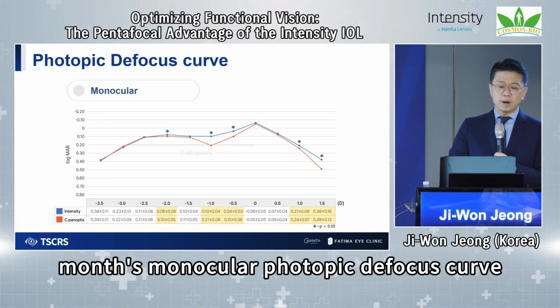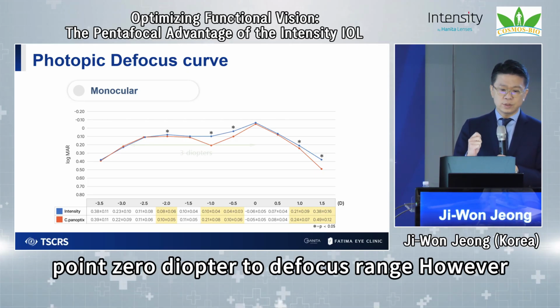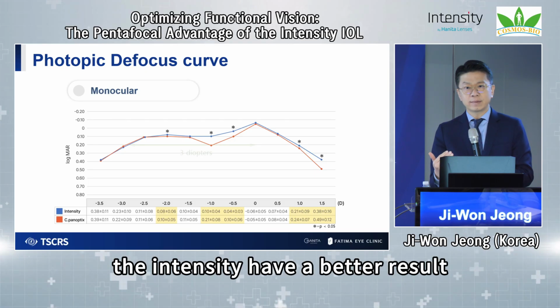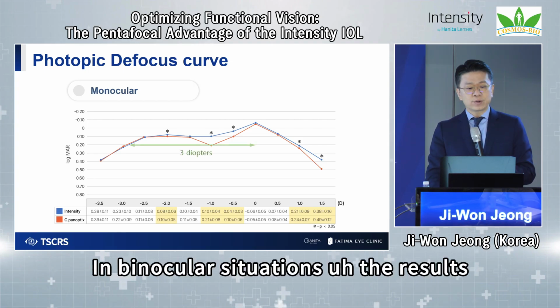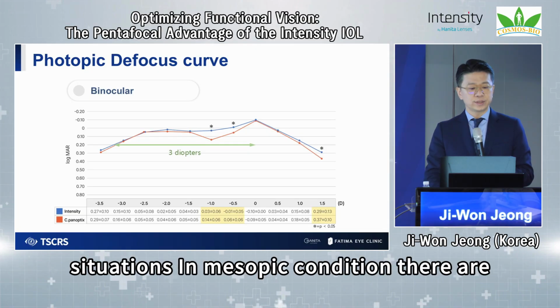This is the postop 1 month monocular photopic defocus curve. You can see very similar results in the 0 diopter range and the minus 2.5 and minus 3.0 diopter defocus range. However, the Intensity has better results in the intermediate range from minus 0.5 to minus 1.0. In binocular situations, the results were very similar to the monocular situations.